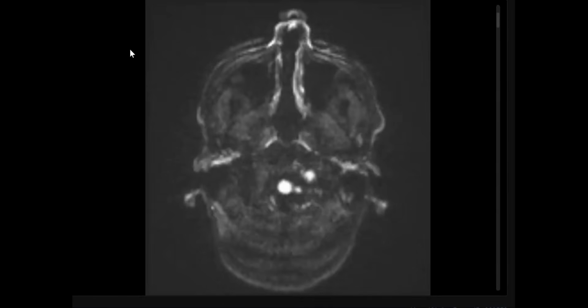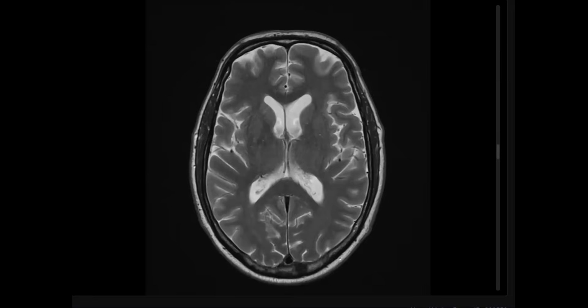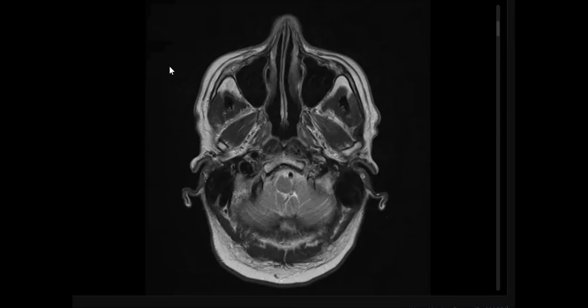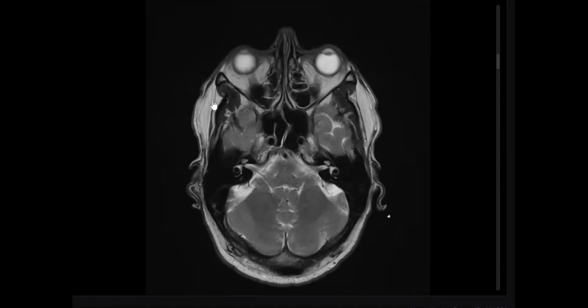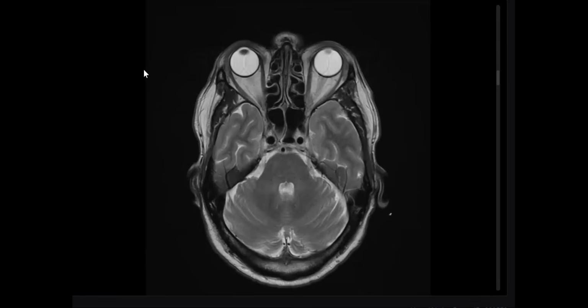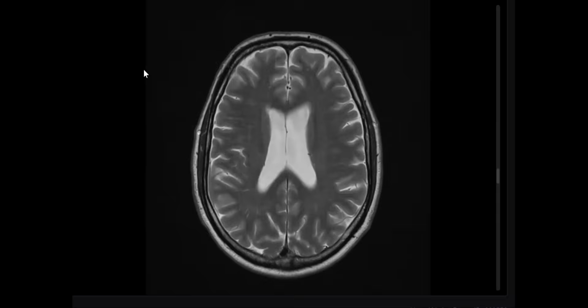Okay, I'm presented with an MRI. I will choose this one first. I've been presented with an MRI T2 sequence of a patient complaining of headache, old age. I'll scroll through the sections from top to bottom to check for any gross abnormality.